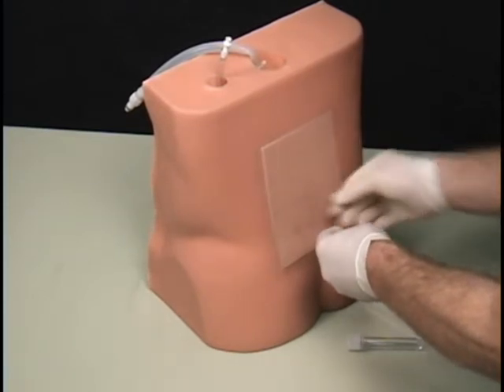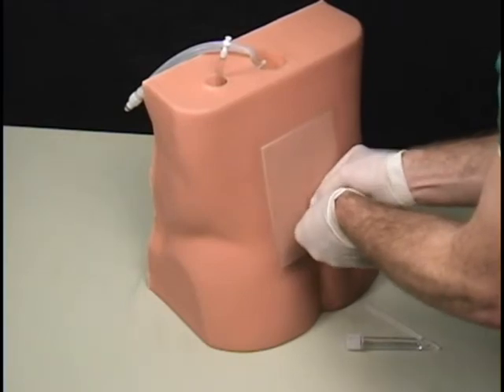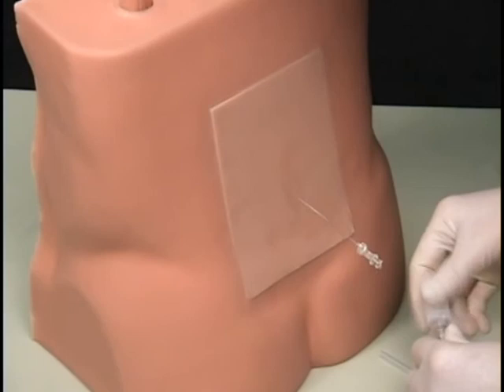During the lumbar puncture procedure, the user will feel a pop and a change in resistance when entering the subarachnoid space, and cerebrospinal fluid will be present when the stylet is removed.